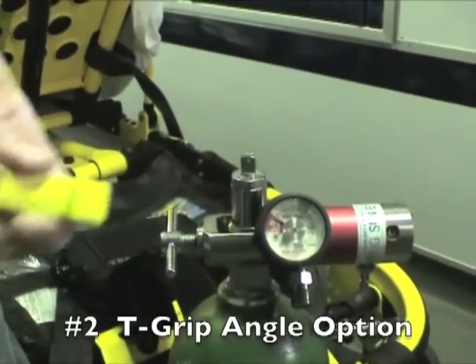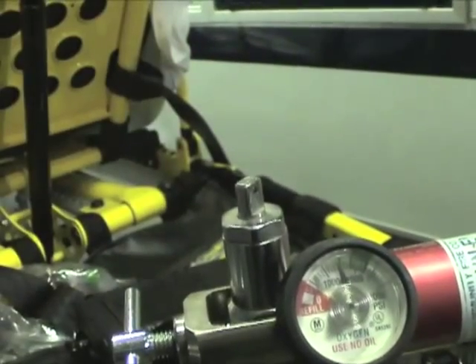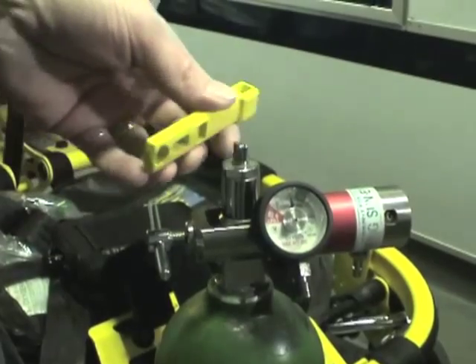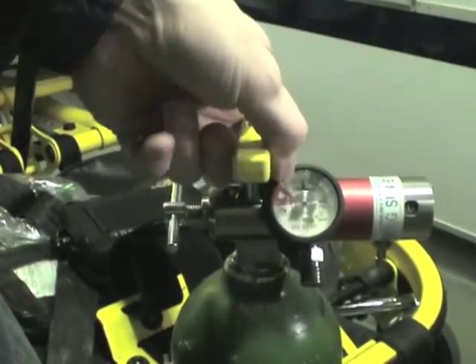Reason number two: the T-grip angle option. There's a slot in the middle of this tool that gives you the ability to use it as a T-grip, giving you comfortable purchase to use when those bottles are sitting open and upright where you can get to them easily. Turn them on, turn them off — comfortable, fits easily in your hand.